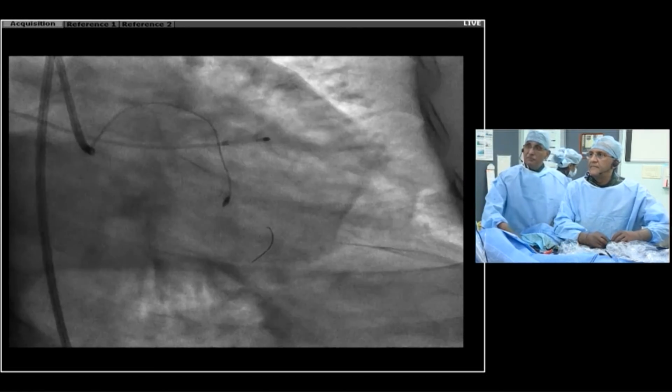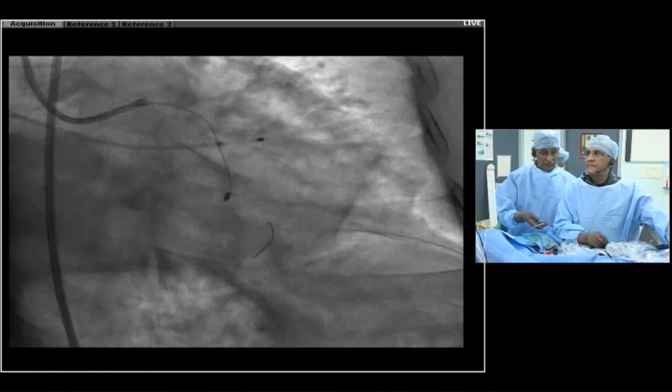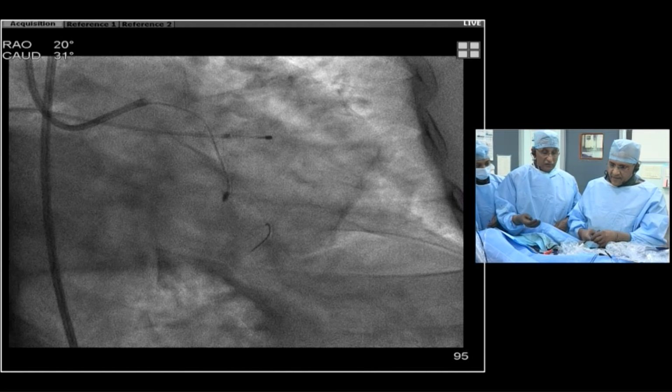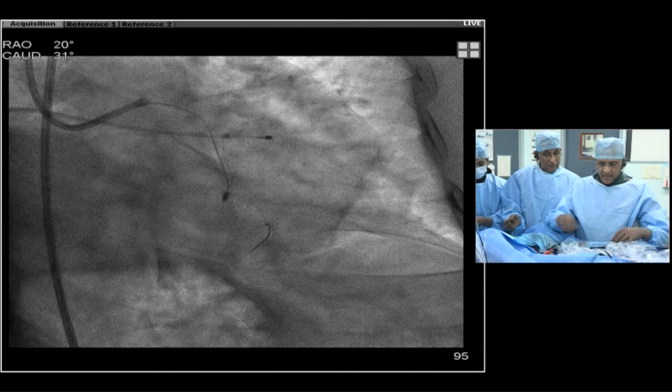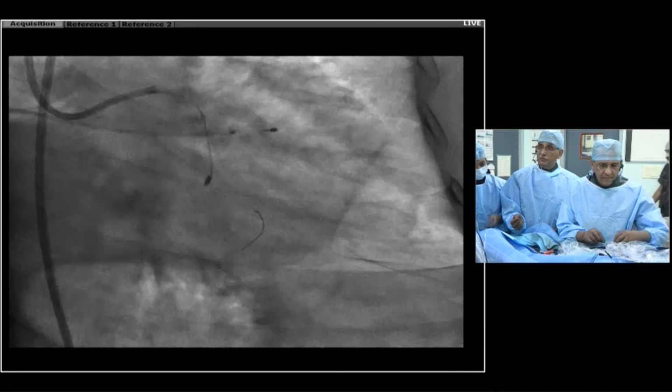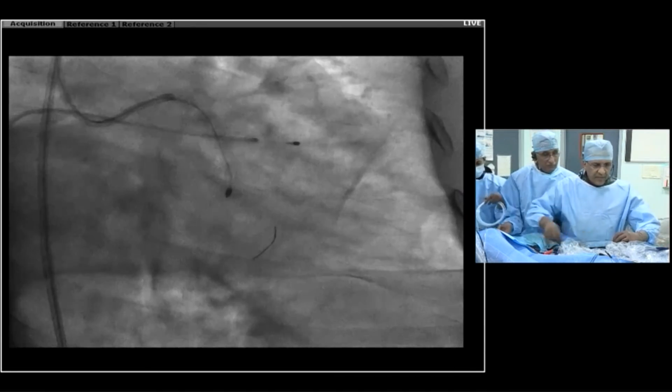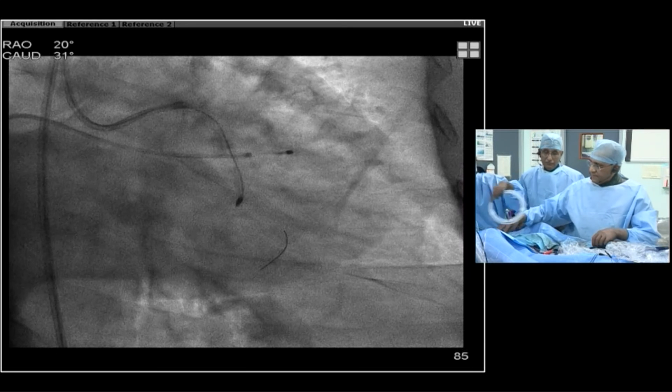If you try to remove the wire, you can really lose position. You can do it with the Guidezilla. I agree. So he'll cut, he'll take the Guidezilla down, and then this is better. Give me the Guidezilla. I think Kirti can work in peace.